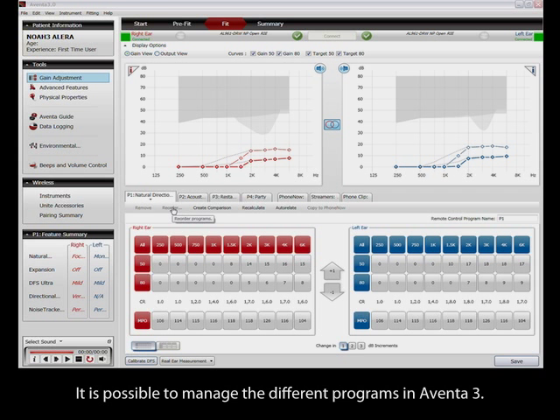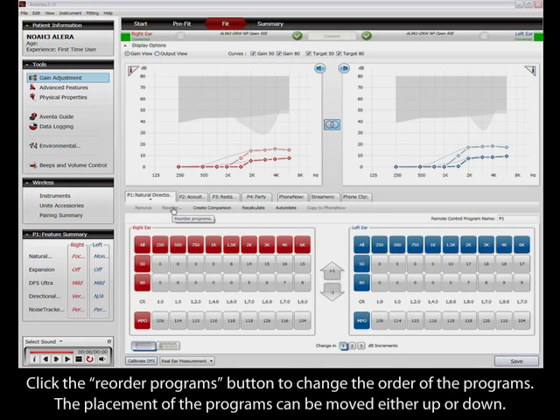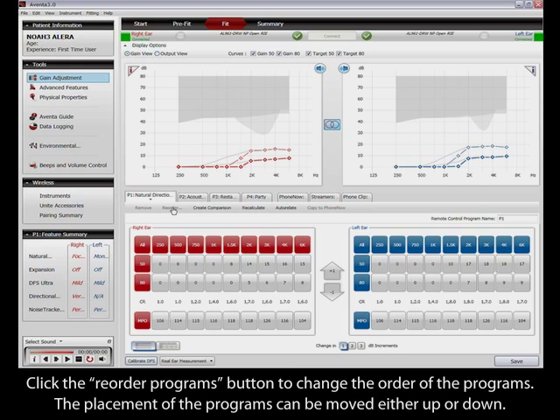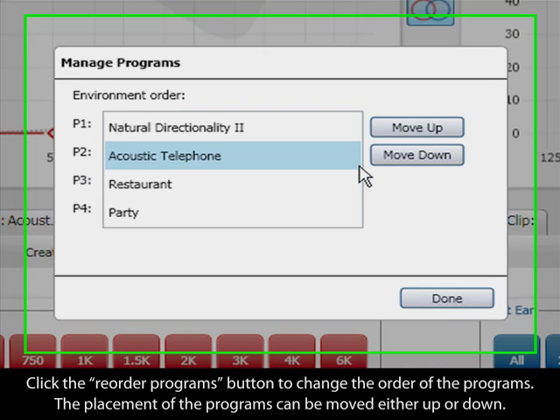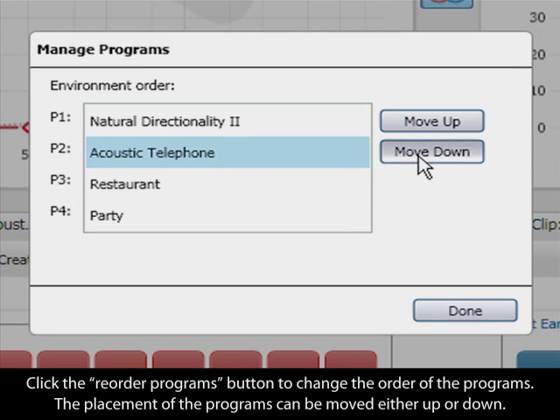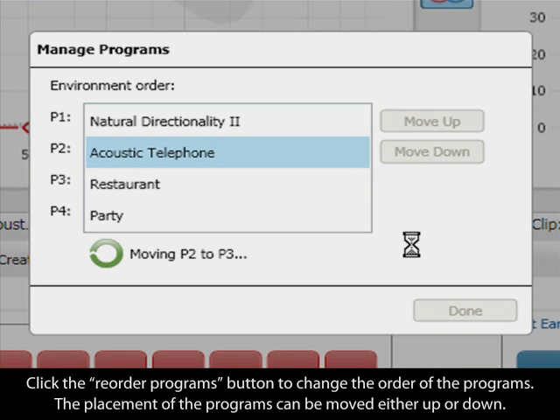It is possible to manage the different programs in Aventa 3. Click the Reorder Programs button to change the order of the programs. The placement of the programs can be moved either up or down.